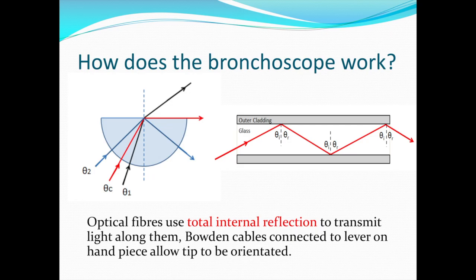These optical fibers use total internal reflection to transmit light along them. Bowden cables connected to the lever on the handle piece allow the tip to be orientated.